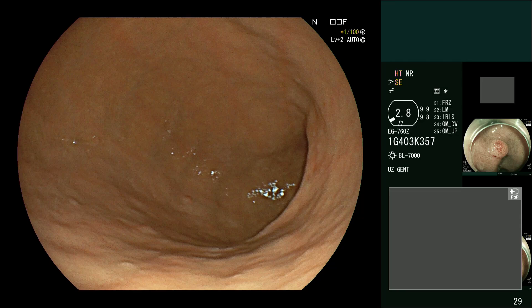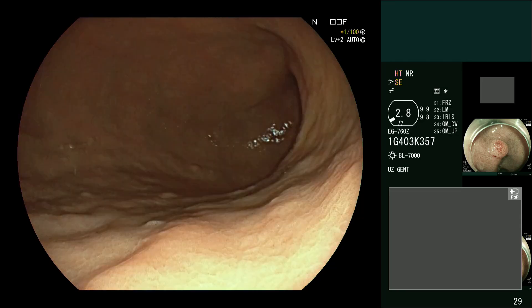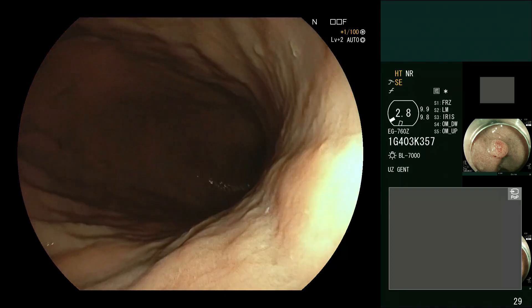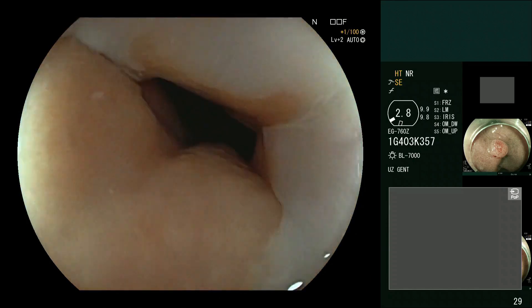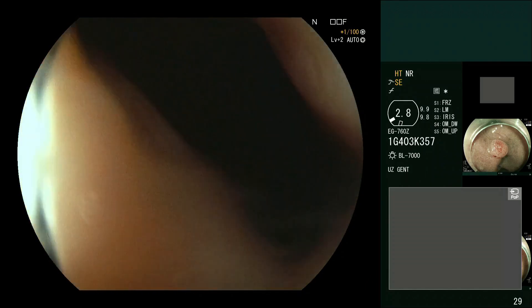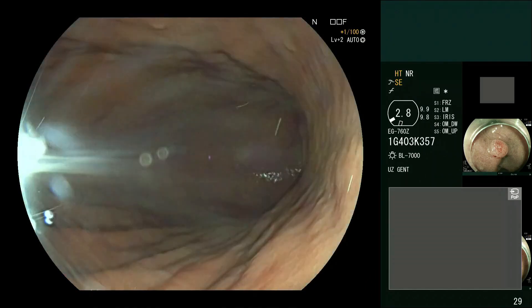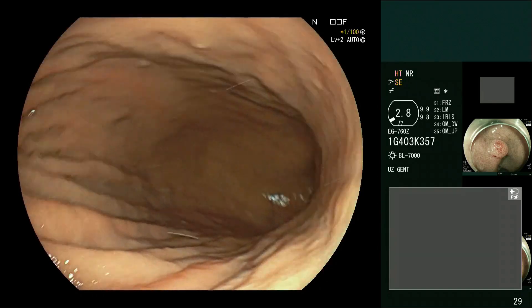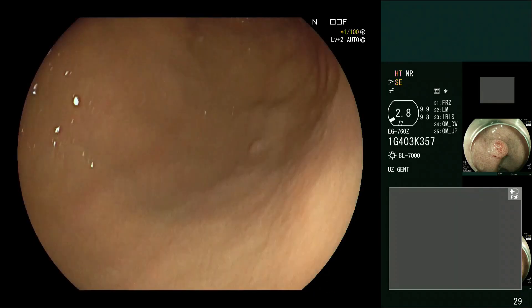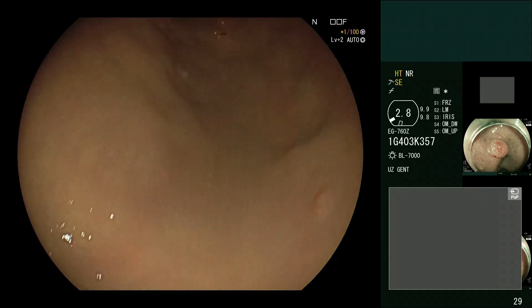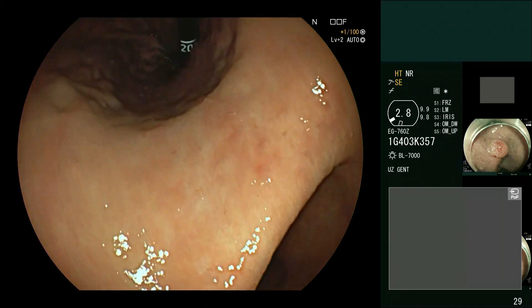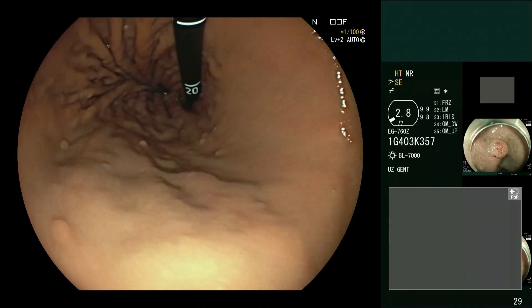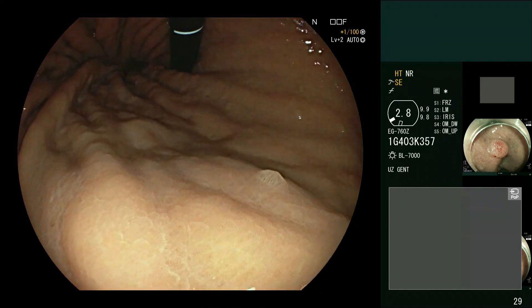Here we are in the stomach of a patient with a previously diagnosed neuroendocrine tumour of the stomach. A quick video on how to look at the stomach and the different morphologies of polyps you might find. No apology for making a lot of these movies because there are a lot of different appearances of the stomach, and if you're going to get familiar with all of them then you need to spend a lot of time looking.